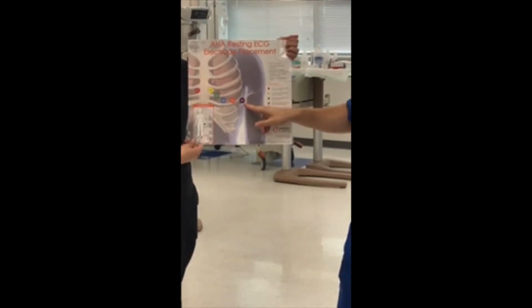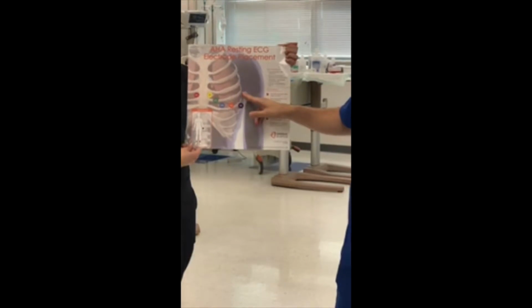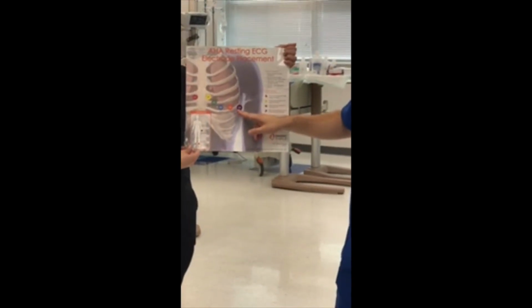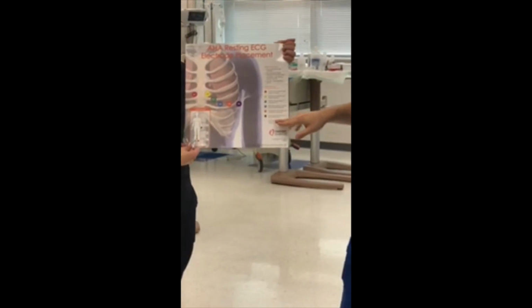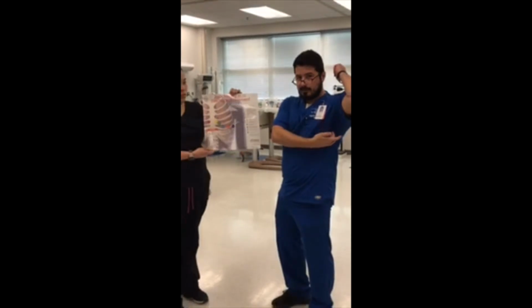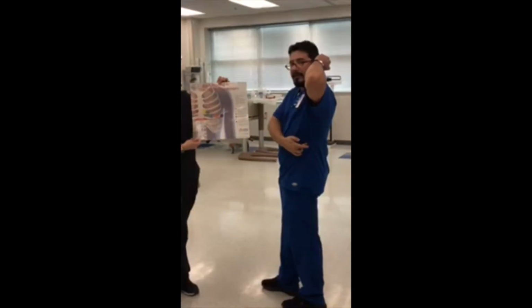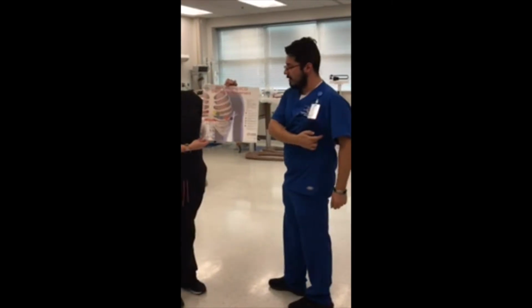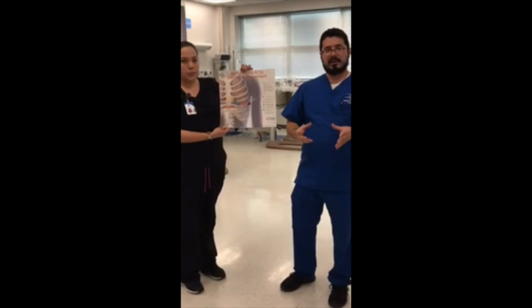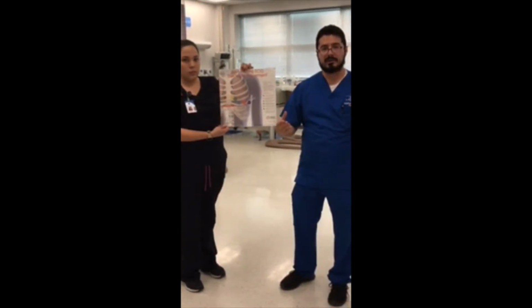V6 may go into the sixth intercostal space because of the way the anatomy of ribs curve. Whether it's V5 or V6, that's okay. What's mainly important, as shown here, is the mid-axillary line, meaning where your armpit is, full lateral transition, that is your axillary line. V6 will be there. All of these together measure the electrical conductivity that runs through the heart to be able to give you the clearest picture.